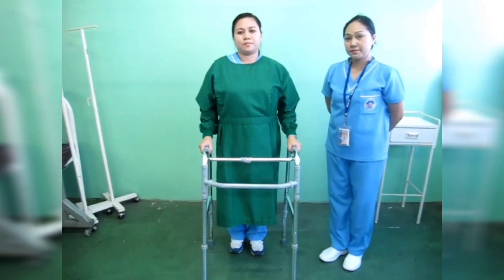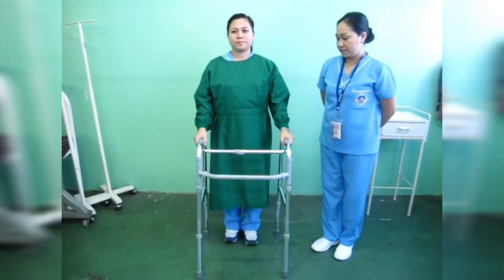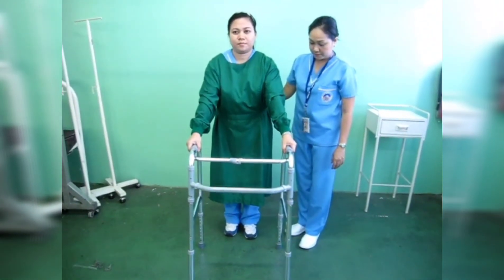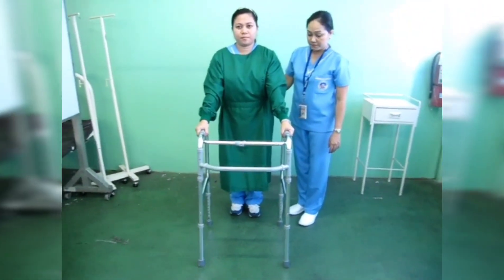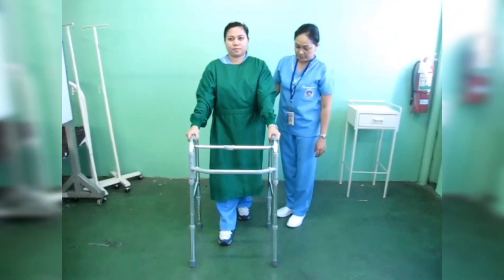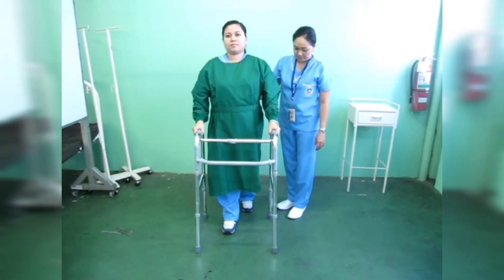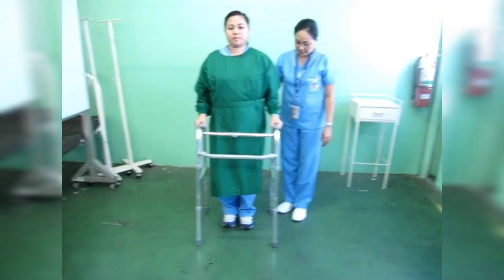Proper procedure when maximum support is required: Move the walker ahead about 15 cm or 6 inches while your body weight is borne by both legs. Next, move the right foot up to the walker while your body weight is borne by the left leg and both arms. Then move the left foot up to the right foot while your body weight is borne by the right leg and both arms.